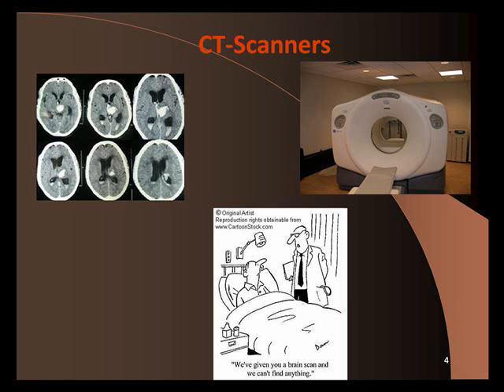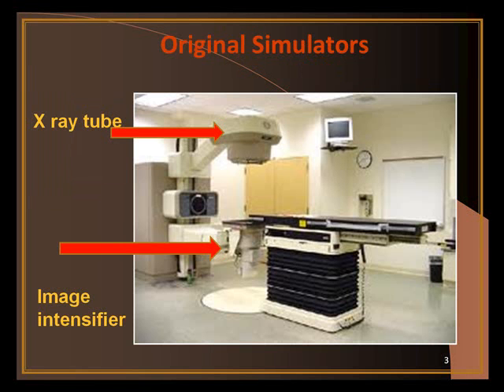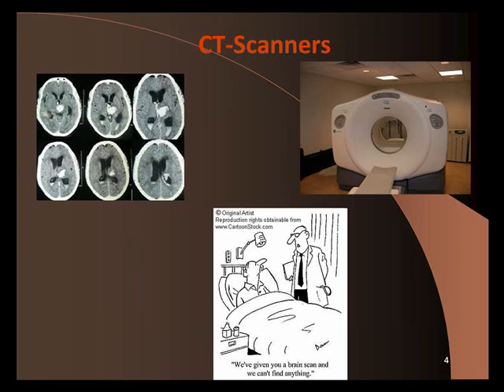Varian still makes them. The newer simulators, let me go back one second. The newer simulators, they'll rotate, and the imaging plate over here will capture a CT scan. So it's basically, it can create a CT scan. Okay, so they've gotten modernized, but most people use CT scanners for the simulation. And these are all just pictures, right? They're not real-time like the fluoroscopy you said.